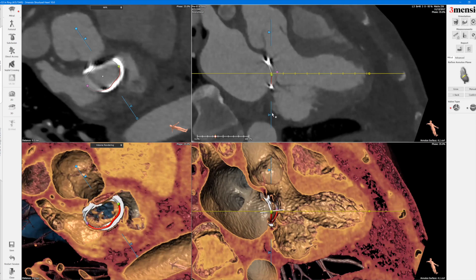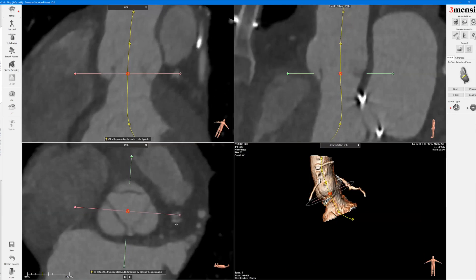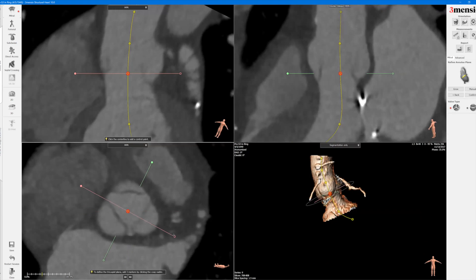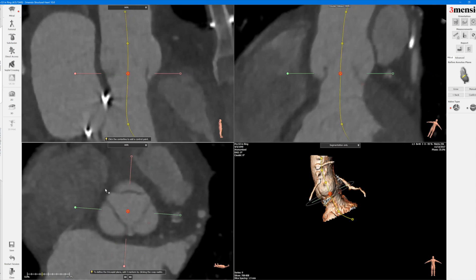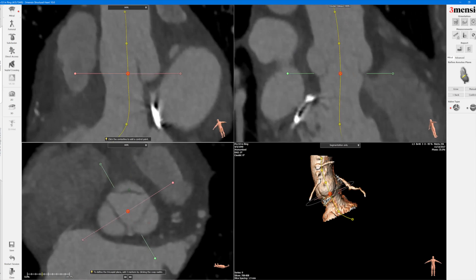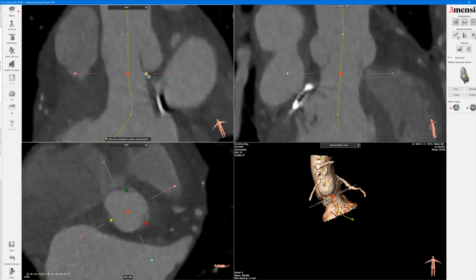Next you can go define the aortic valve just like what you do for a TAVR workup — you can see some of my videos on my YouTube channel showing how to work up the TAVR, which is similar. You put your open red circle by selecting the left sinus, then on the top left panel put a dot at the bottom of the left sinus, rotate counterclockwise to the right sinus and do the same at the base of the right sinus, then rotate again counterclockwise to the non-sinus and put the dot at the base of the non-sinus. Now you have the aortic valve annulus.